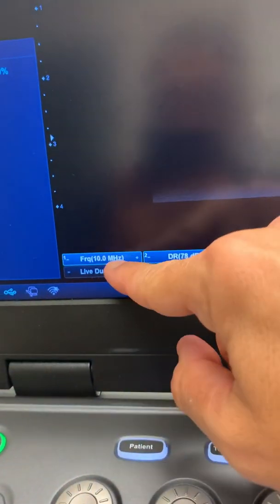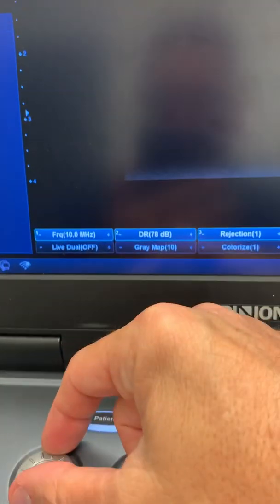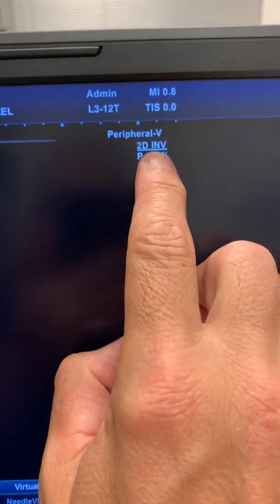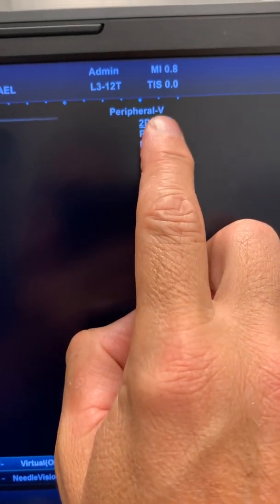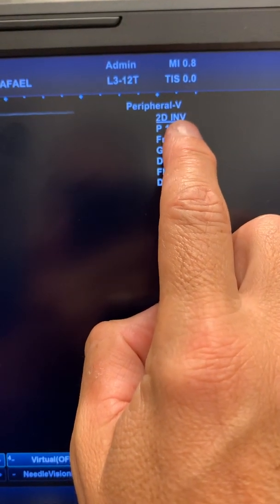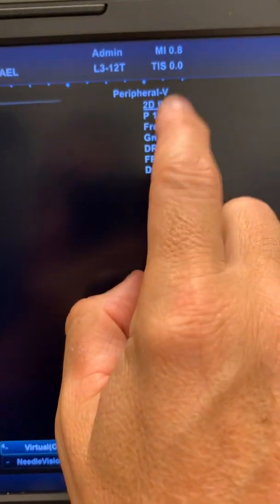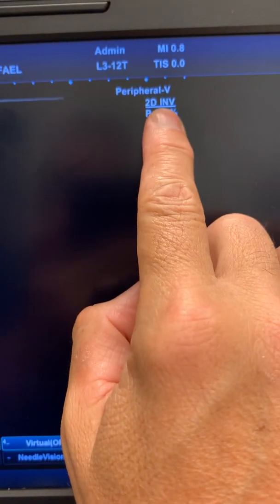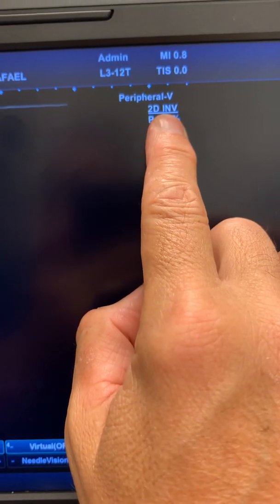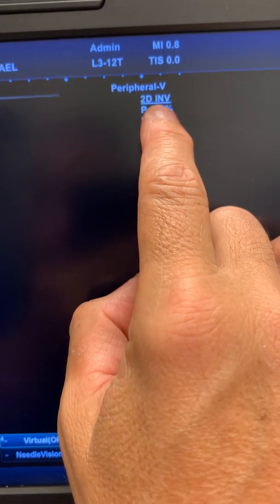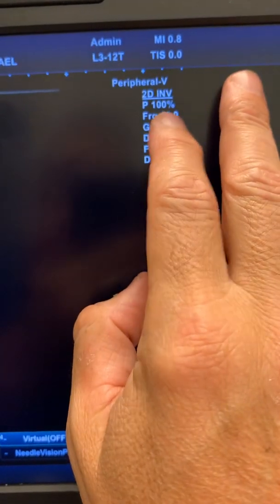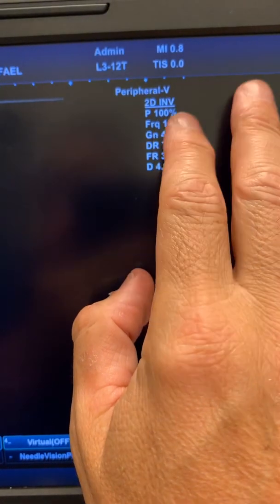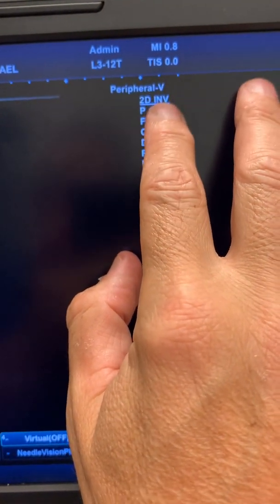If I rotate the knob one more time, it will go to INV which is Pulse Inversion Harmonic Imaging. This actually shows you the third harmonic. This is a really good one for doing vascular when you need to go deeper, when you need to see a vein that is deeper.